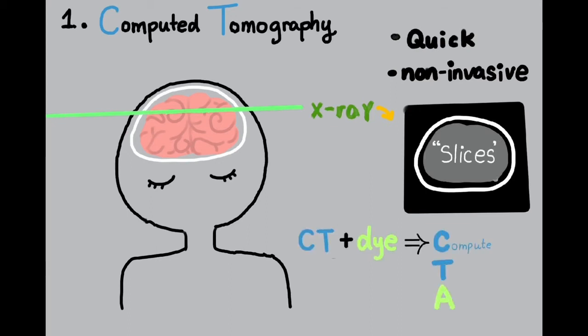Sometimes dye or contrast is injected into the veins during the CAT scan to look at the arteries and see if there's a possible aneurysm. When injected with dye, a CAT scan is called a CT angiography or CTA. CTAs can show the size, location, and shape of an unruptured or ruptured aneurysm. Sometimes we use this CTA to follow if aneurysms have grown over time or how they are doing in the years after an aneurysm is treated.